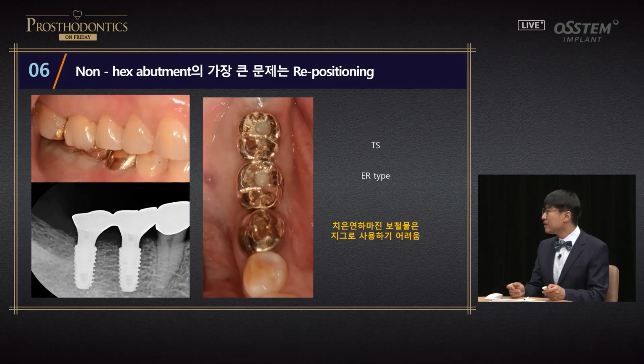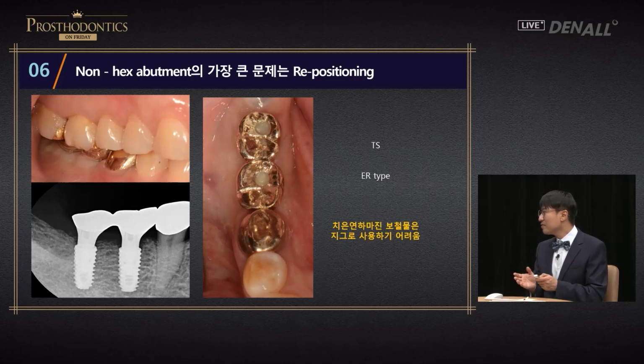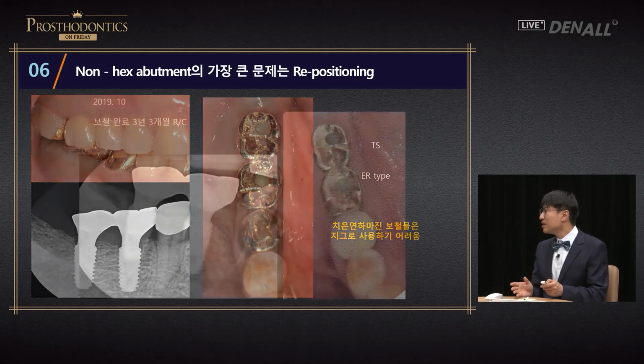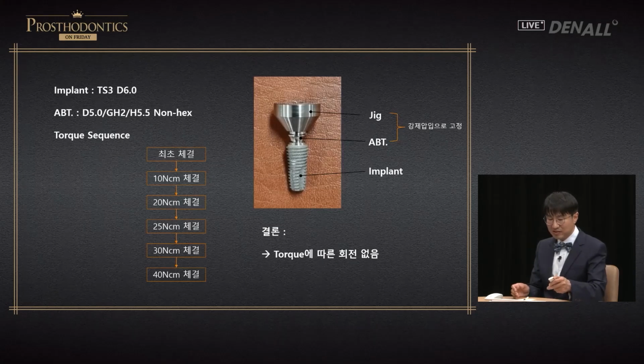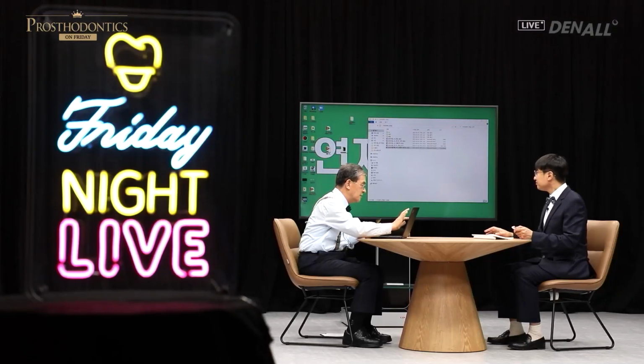If you ask me if I can use subgingival margin prosthesis to do repositioning, actually it's going to be extremely difficult. As shown, if it is a 2-unit restoration and if the contact difference is minimum and has a supragingival margin, you can use prosthesis as jig. But if it is a subgingival margin prosthesis and if the contact difference is large, you cannot do so. You either need to use the original jig or make a new one.